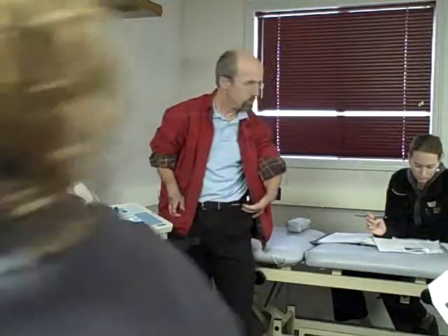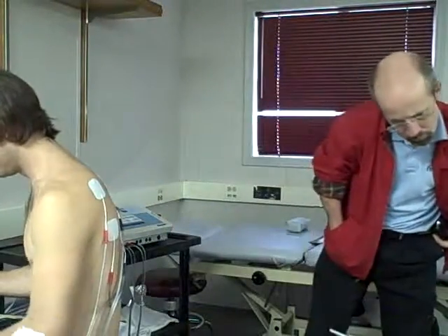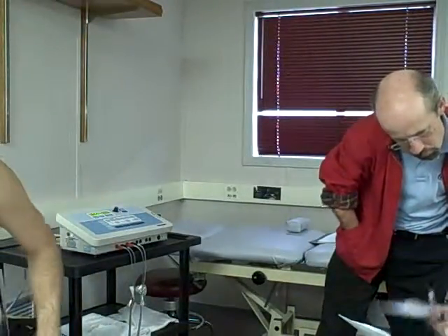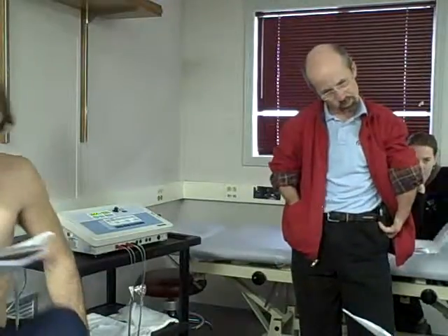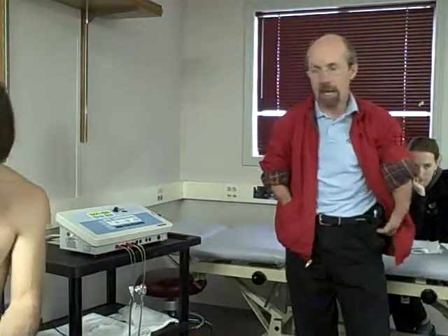I think that's based on the scenario that she wants, though, on the lumbar spine. She wants us to actually have it put on the lumbar spine and ask people. What she wants Joe to do is explain pre-modulated Russian high voltage microcurrent, and then we can get together. In fact, you know what, that's a good point. So let me push through it. It won't take long at all. We gotta do it now. I usually script them. Let me push through these.